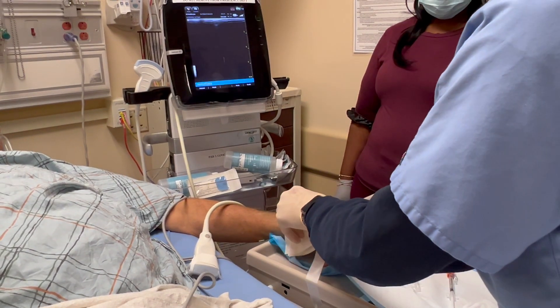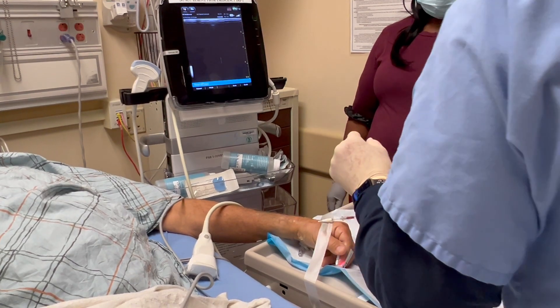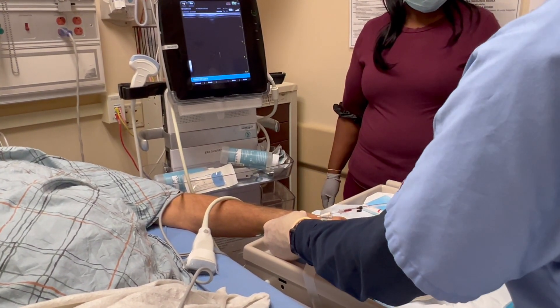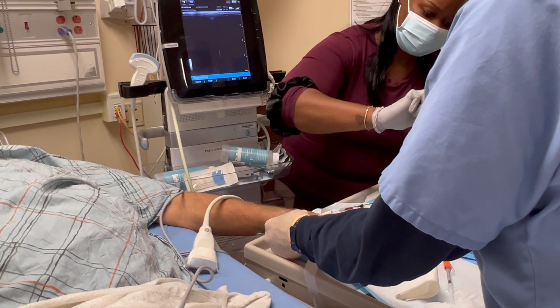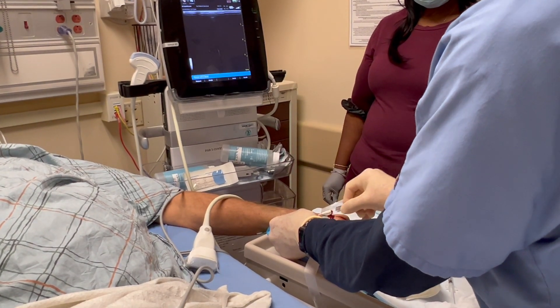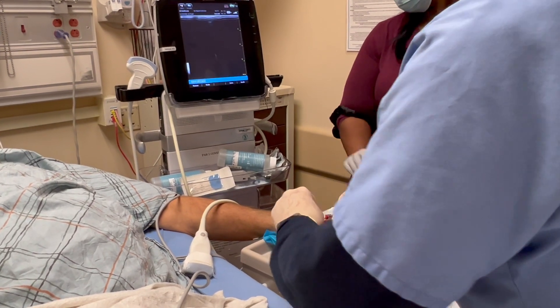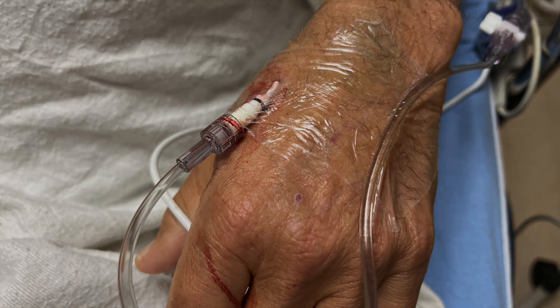And once it's in, you can go ahead and do all the other procedures that you would normally do for an arterial line — get it sutured in place and hooked up to your monitoring system. Just hook up to the monitoring transducer, then suture it in and you'll be all set to go. And that's it — distal radial artery cannulation.